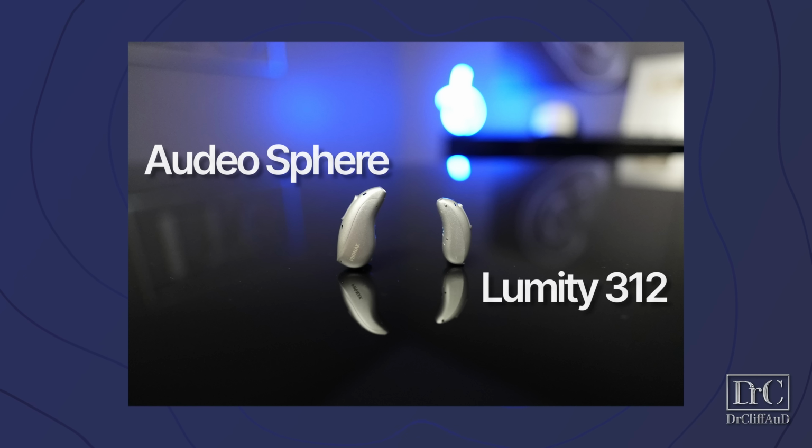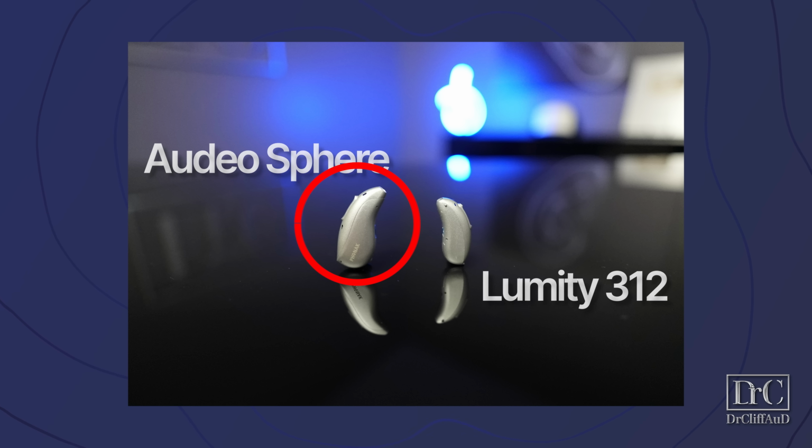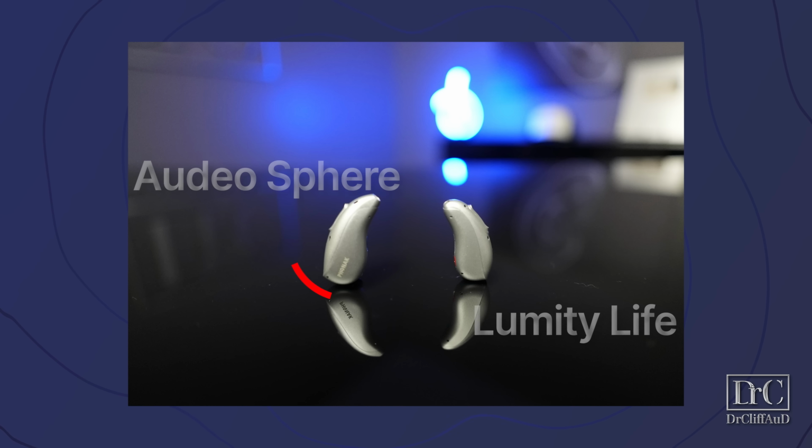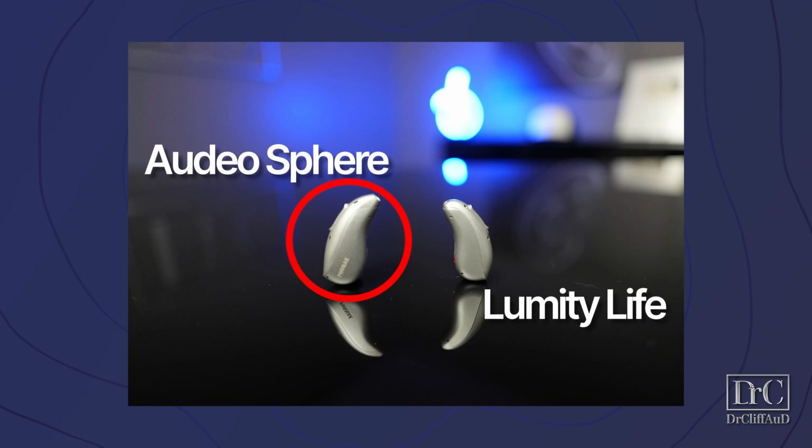Right here, we're looking at the size comparison between a Phonak Audeo Lumity 312 disposable battery hearing aid. You can see that the Sphere Infinio is significantly larger than this previous generation device. If you compare the Sphere Infinio to the previous generation Lumity rechargeable hearing aid, you can see that yes, it is also bigger than that hearing aid, and it is even bigger than the previous generation Lumity Life rechargeable hearing aid, which up until this point was the largest hearing aid that Phonak had.